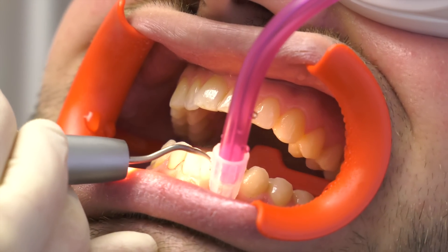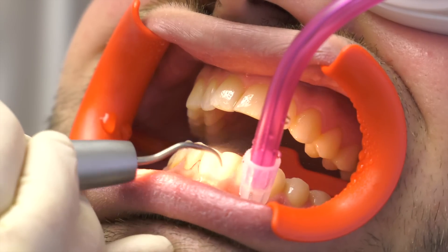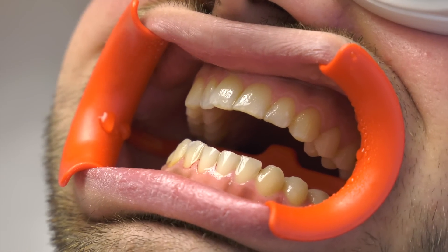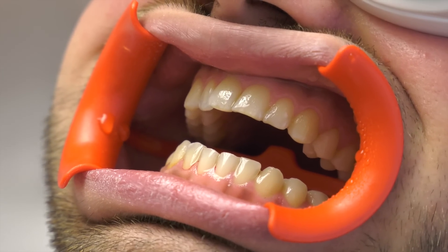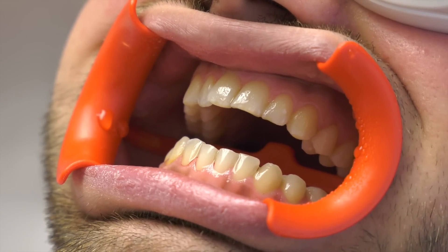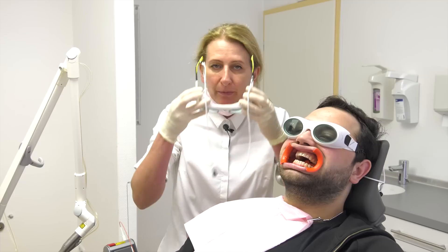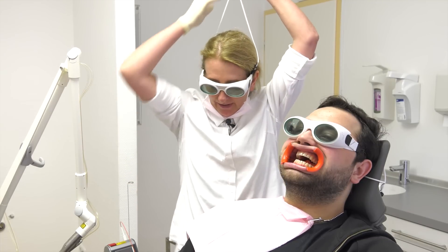The advantage of this kind of dental scaler is that it removes the tartar very quickly. The disadvantage is that it does hurt at the sensitive tooth neck. This is the reason why I change my medical equipment, and at the sensitive tooth neck I will use the Erbium YAG laser to take off the tartar.